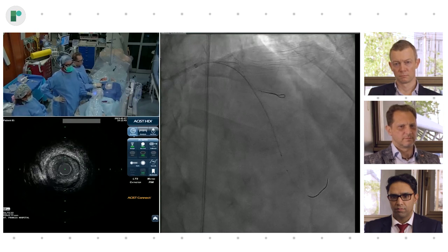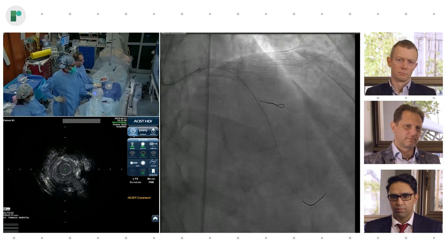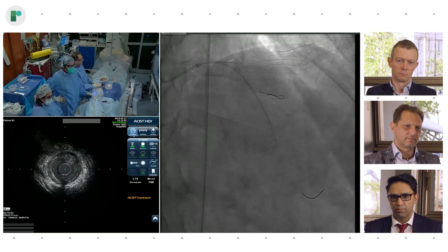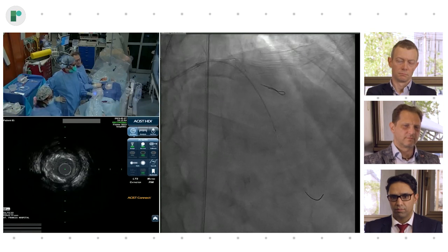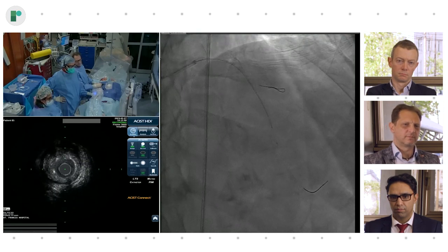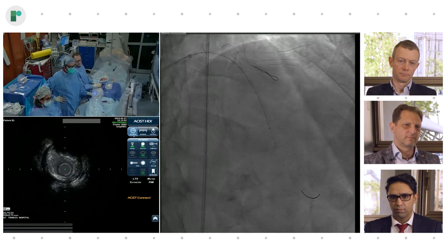So what he's going to do is, this is a little bit distal. We're going to record on manual. So I'm just perusing manually the distal vessel to try to figure out. This is not bad, right? Here. That is not bad. Let me get into the lesion more, which is here. So yeah, I think that's going to be the landing zone. So I'm re-advancing to find that landing zone, which is right here. Just a little bit more, I think.